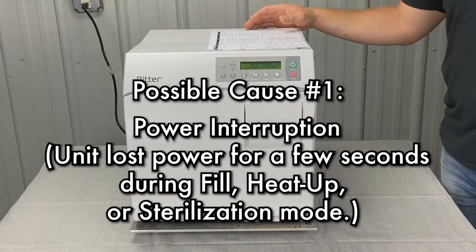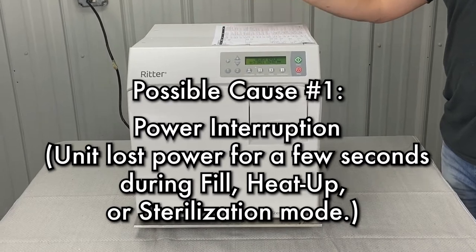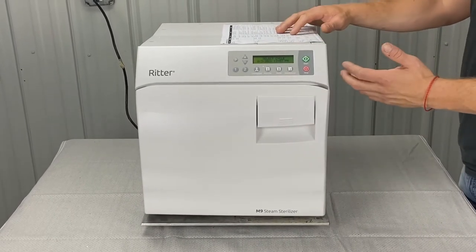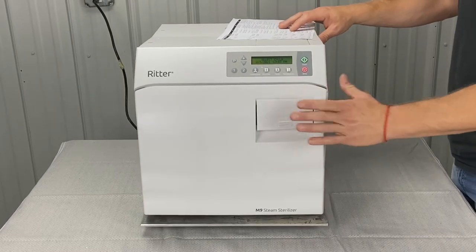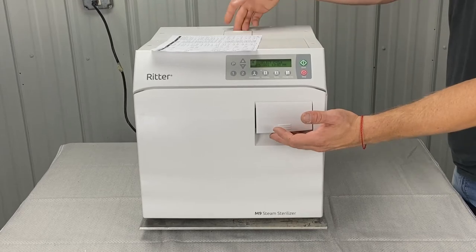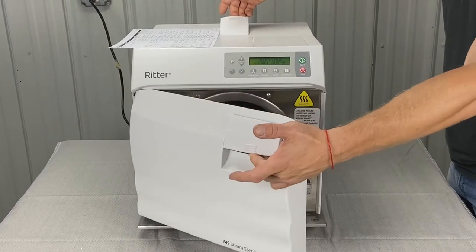So power interruption — the unit lost power for a few seconds during fill, heat up mode, or sterilization mode. If it lost power, there might be pressure inside the chamber. The door might be shut and you might not be able to get it open. There is a pressure relief valve in the back here — just pull up on that and you should be able to open the door.